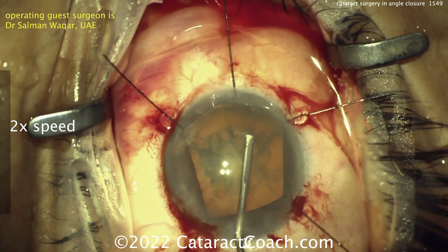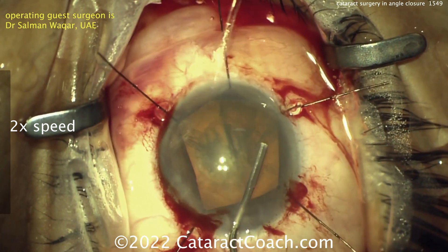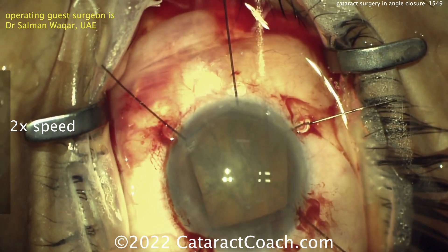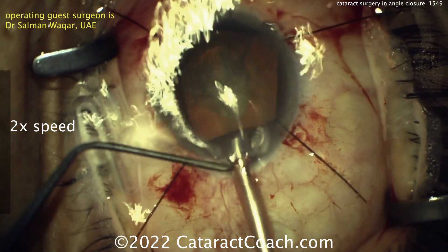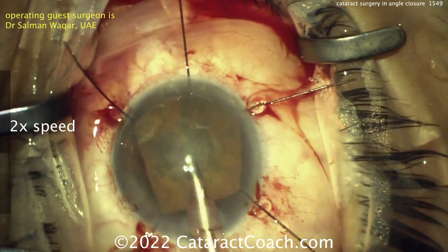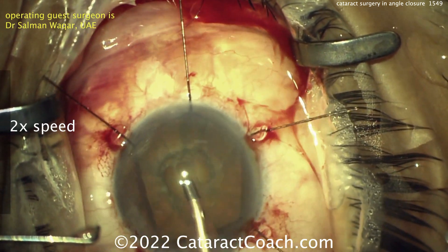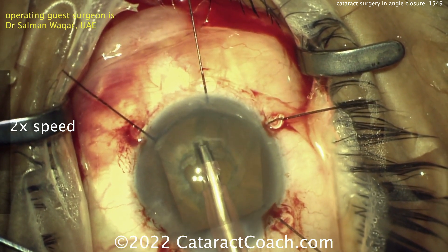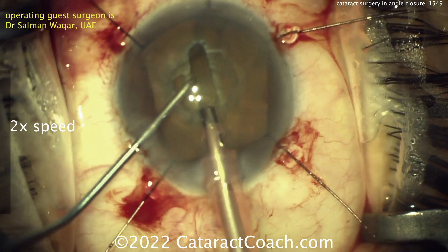A little hydrodissection. There's not a lot of room in the anterior chamber — very shallow AC. This is a great case where you want to debulk the nucleus in the bag. So this is a case where doing some grooves, like a divide and conquer technique or a stop and chop, is really helpful to get extra working space. If you just do a quick chop in the bag, you get four quadrants each at about 25%. But if you debulk it by doing some grooves and a divide and conquer, then each quadrant is obviously less volume — maybe 20% of the total nuclear volume.